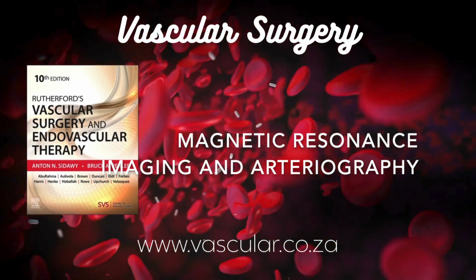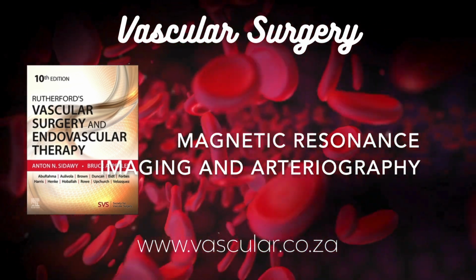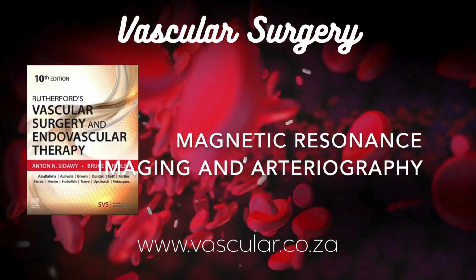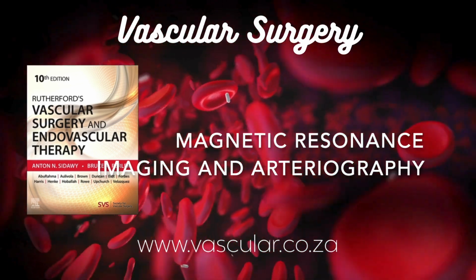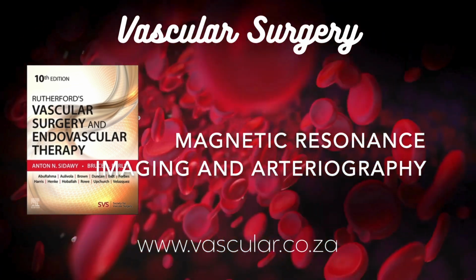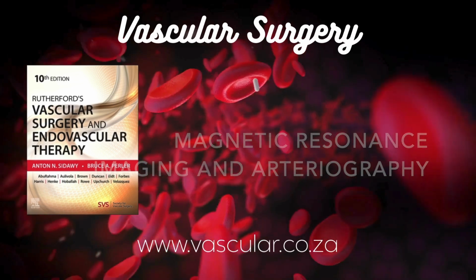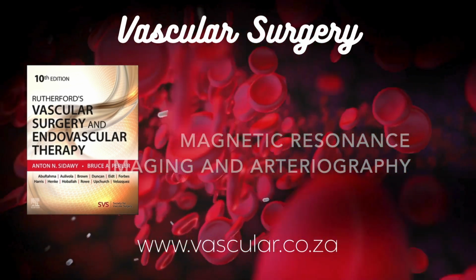Okay. Really exciting that these non-contrast options are improving, especially given the kidney concerns. Now, let's flip to the other side. Contrast-enhanced MRA. This sounds like it's still a cornerstone technique. How does it work? It definitely is. Contrast-enhanced MRA, or CE-MRA, uses those gadolinium-based contrast agents, the GBCAs. When these are injected into your bloodstream, they have a specific property. They dramatically shorten the T1 relaxation time of the water molecules immediately around them. T1 again. Yep. And because, as we said, MRA typically uses T1-weighted sequences, that shortening effect makes the signal brighter. Exactly.